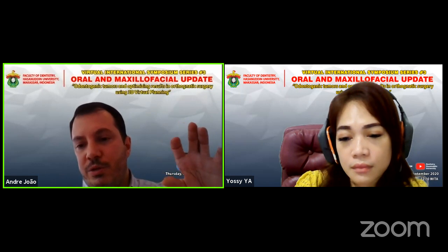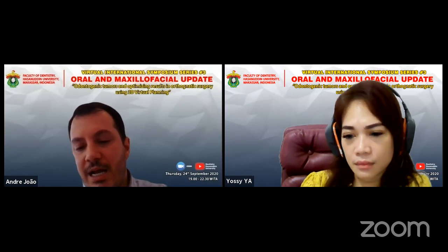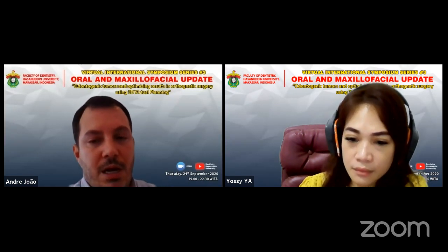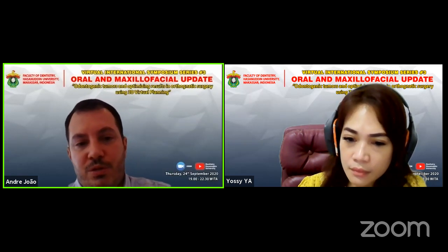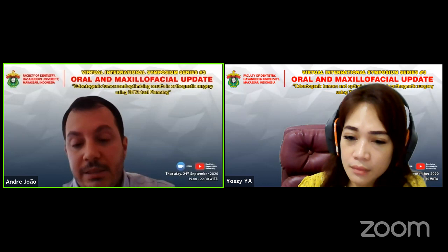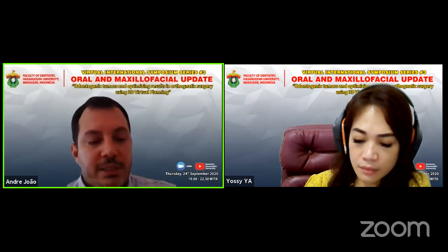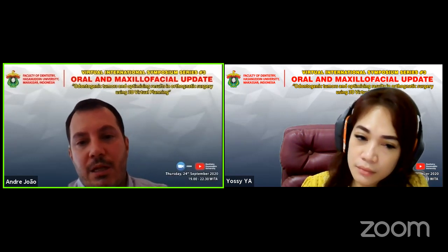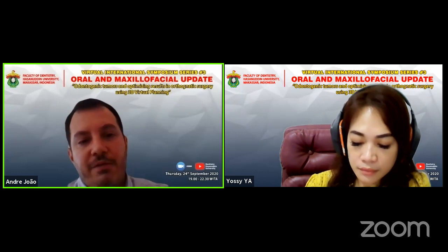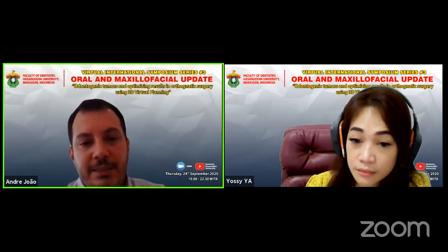But with aligners, you plan your final occlusion. You design in a 3D environment how you want to end up with each individual tooth, and then you go from the ideal occlusion all the steps backwards, and the software will create aligners that move every single tooth in the way that you planned it.